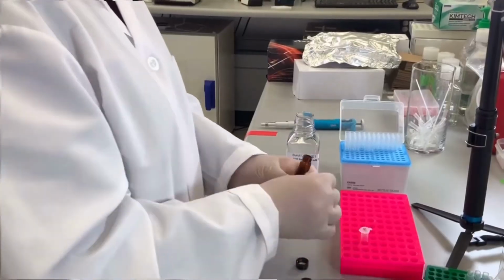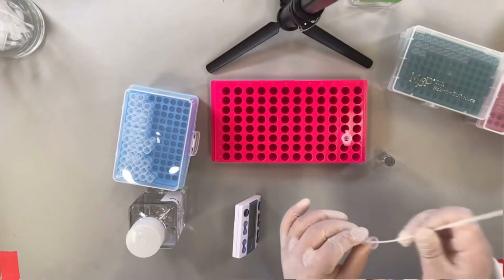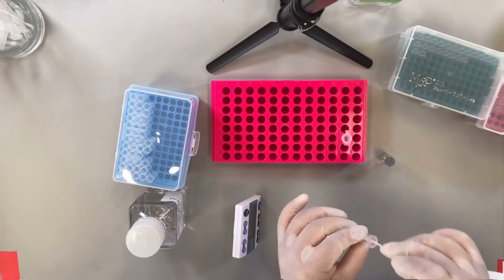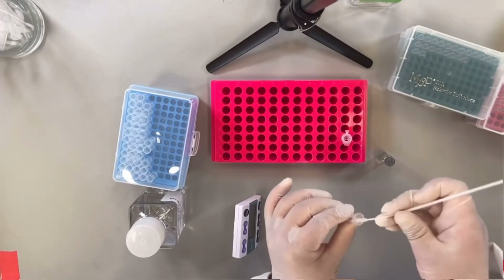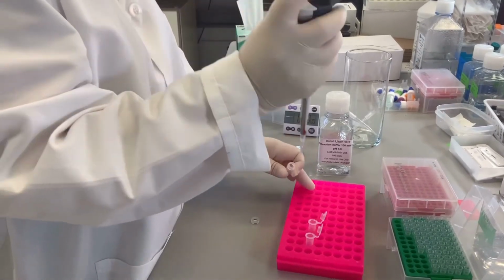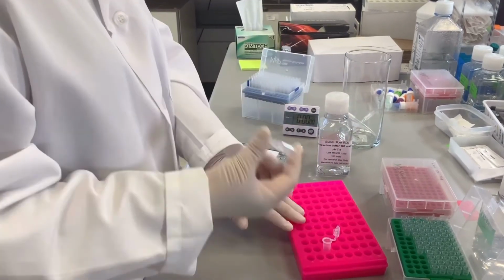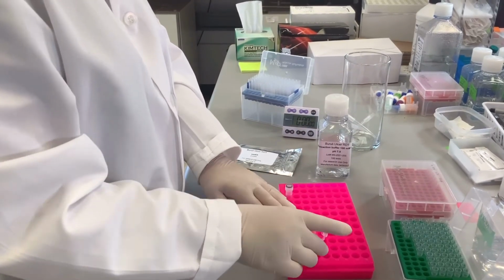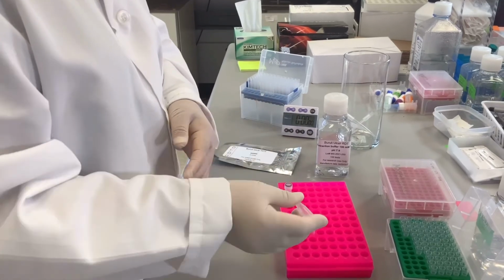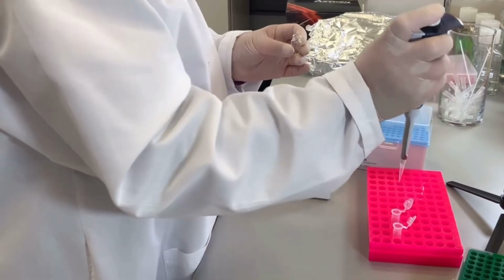In the meantime, place the collection swab into 500 microliters of extraction buffer for 5 minutes. After 5 minutes, mix and then squeeze against the wall before removing the swab from the vial. Then add 50 microliters of the reconstituted HABA to the mix. Shake manually to combine. Then add 50 microliters of the reconstituted nanoparticles.